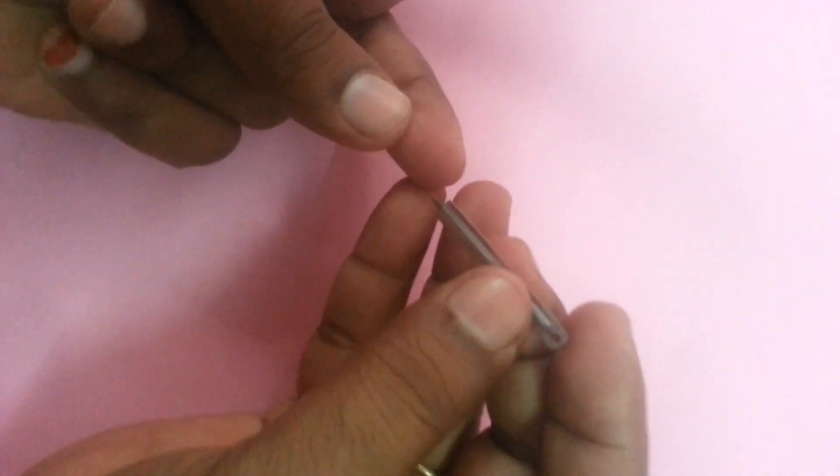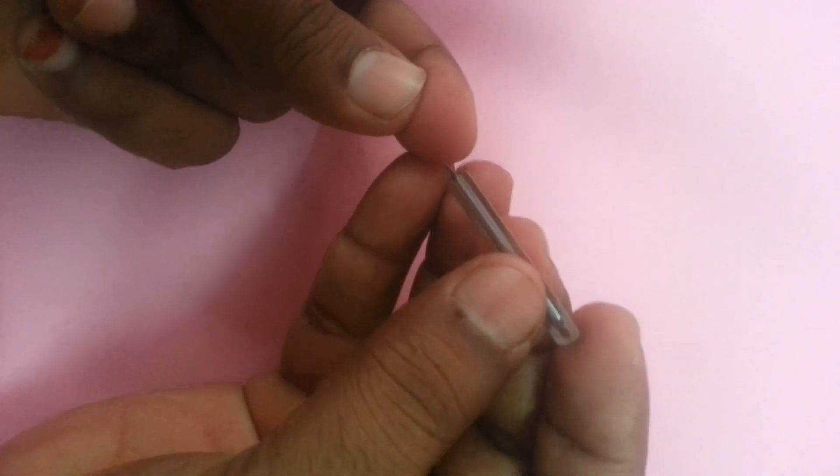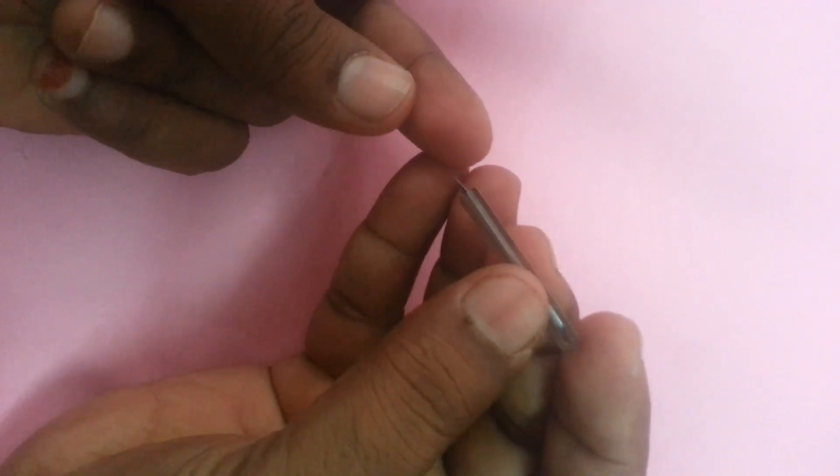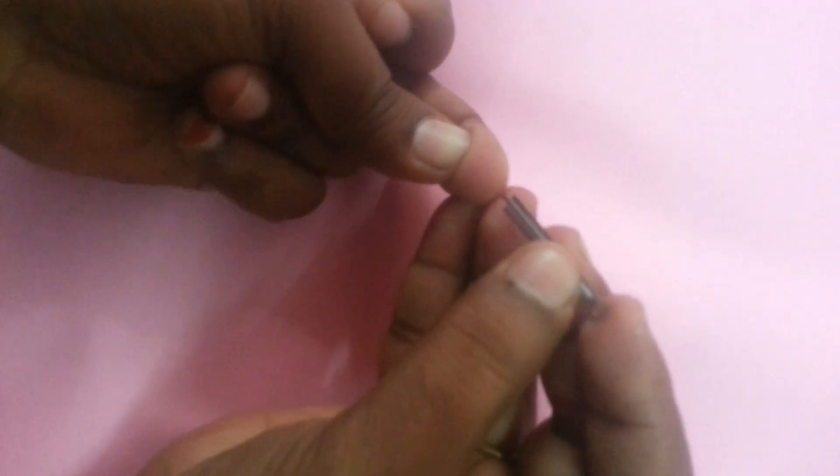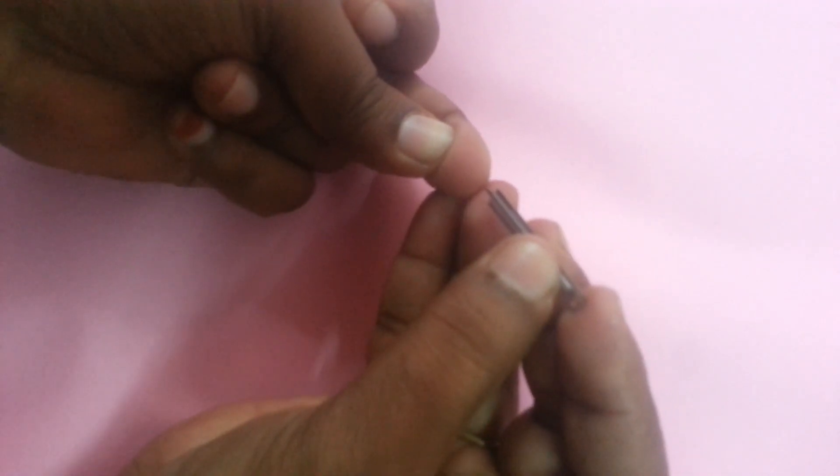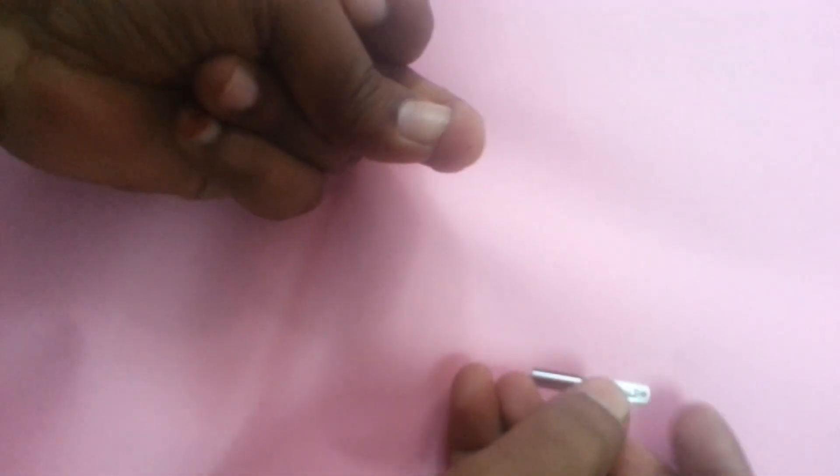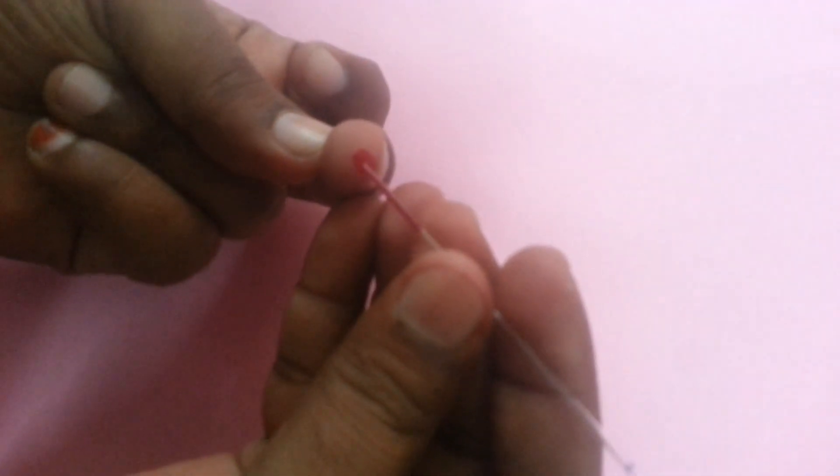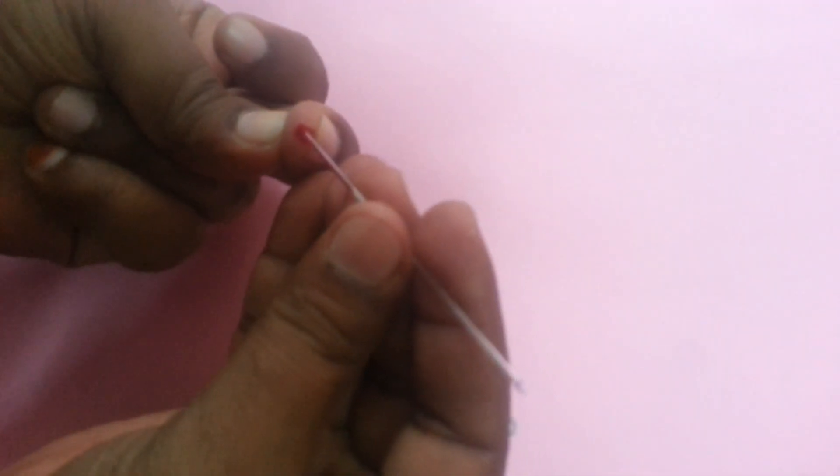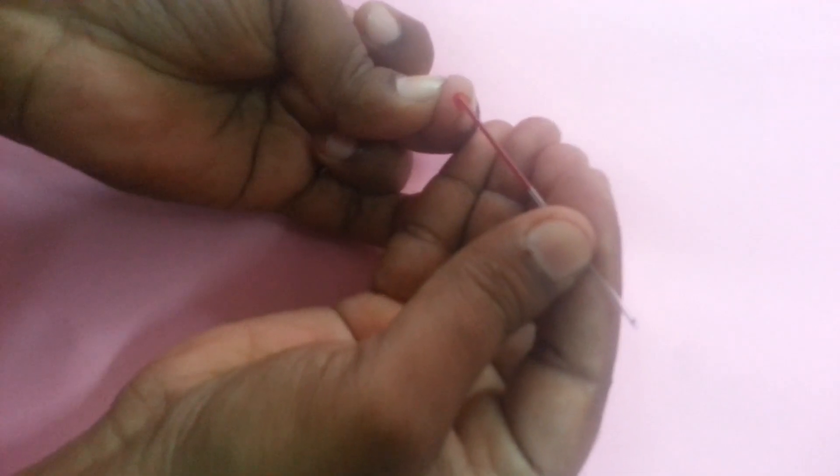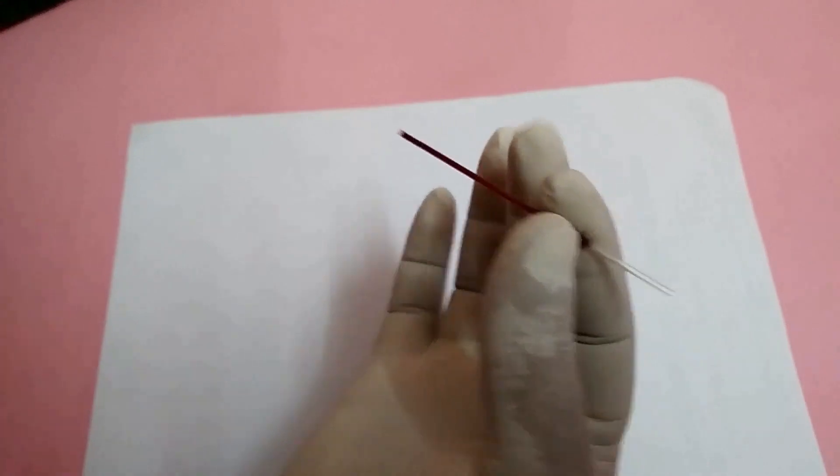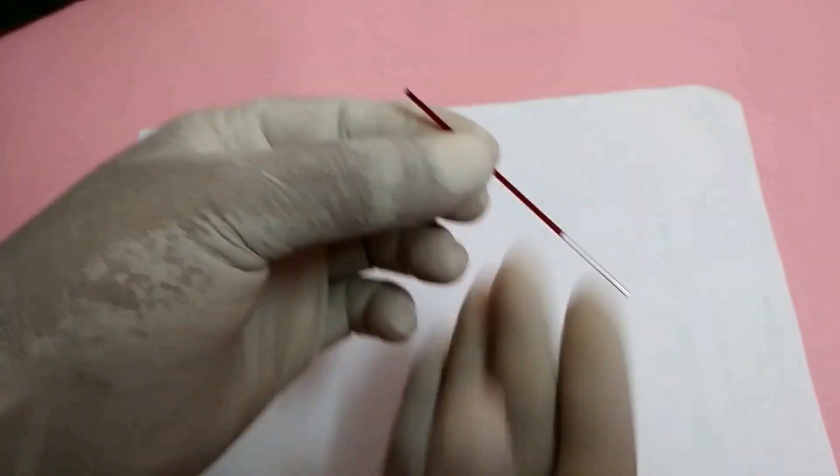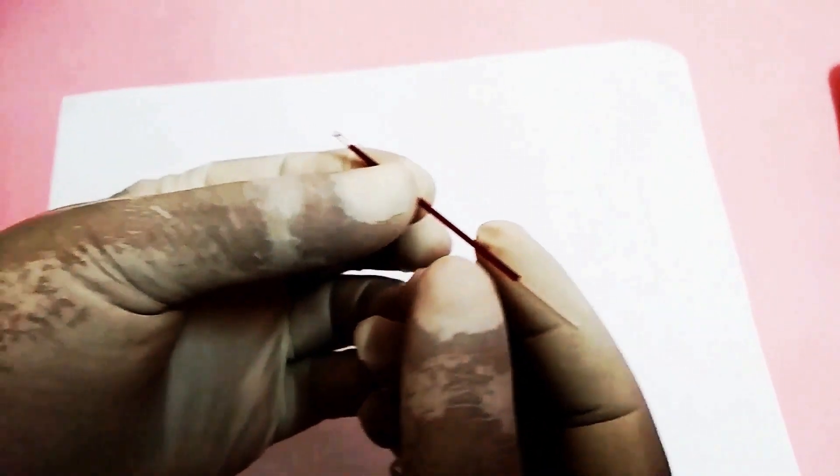Collect blood in capillary tube. Here we can see blood is filling in capillary tube due to capillary action.